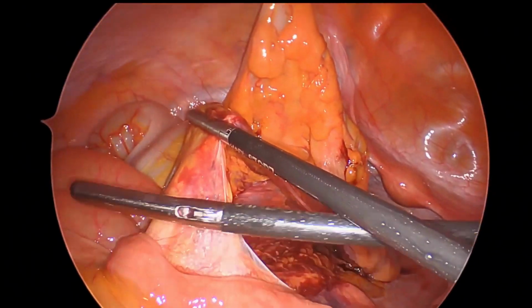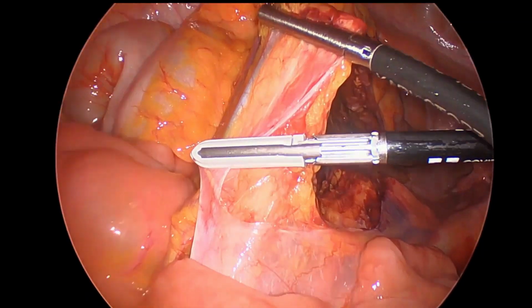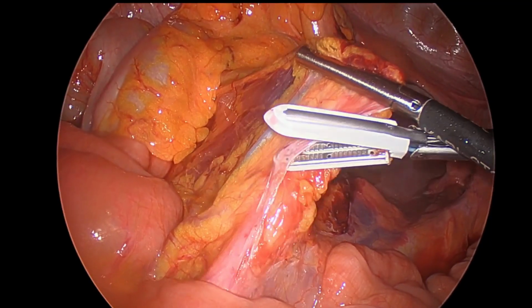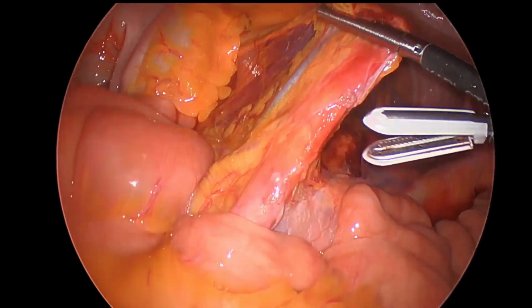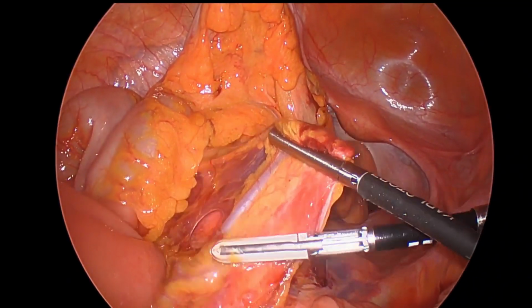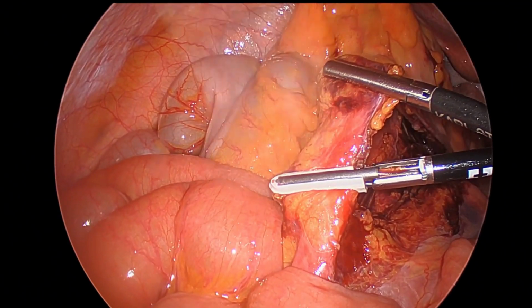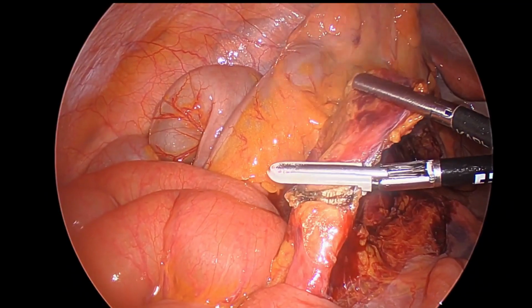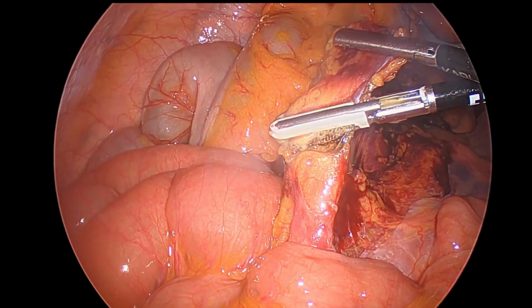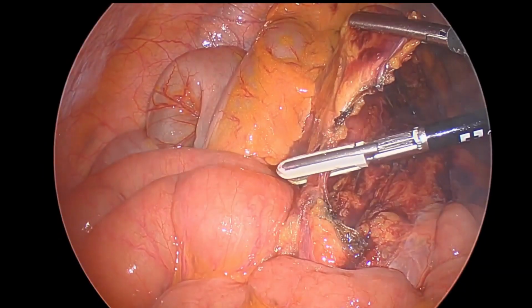So now we're going to take the vessel, we're taking the peritoneum over top of it. I just want to point out that here we're not doing a high ligation, we're taking the pedicle just distal to the left colic takeoff. There's no real oncologic benefit when doing a low anterior resection of taking the IMA pedicle, but of course it's very important that one consider taking the IMA pedicle flush with the aorta or just distal to the aorta if you really want to gain maximal length on the colonic conduit. That's my tip about go low to go far.